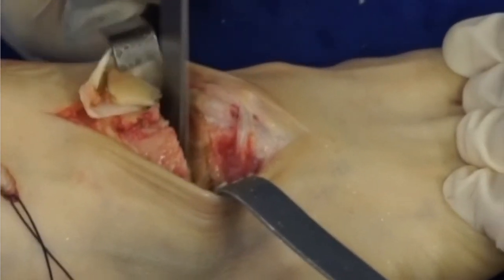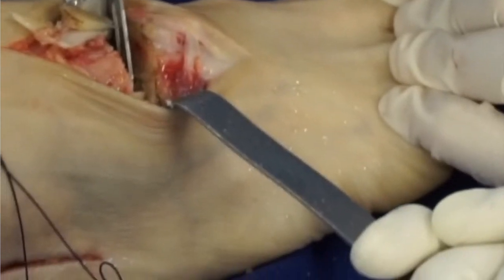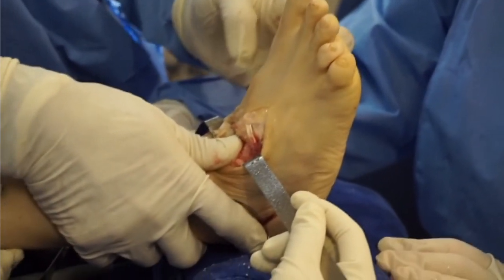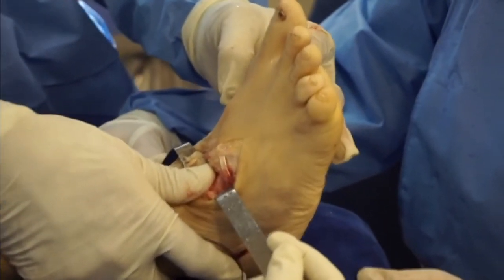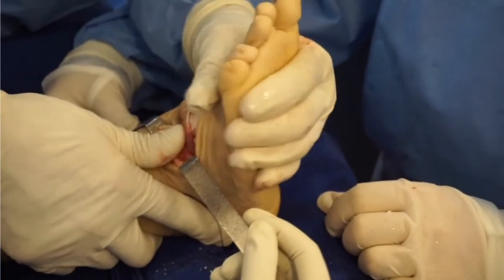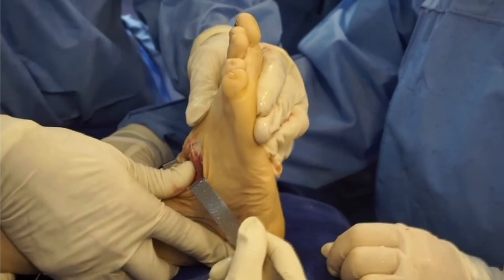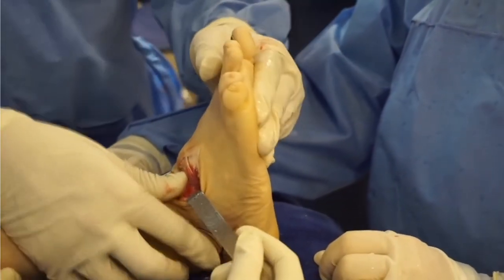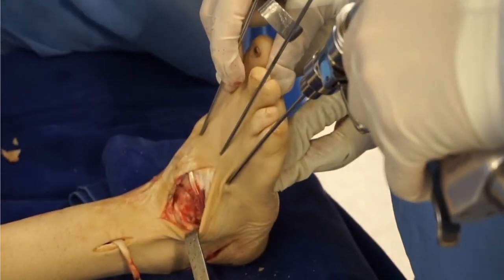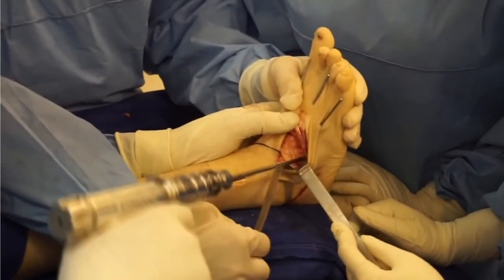The wedge of bone is now easily removed, and once you've got it out, you can actually see the articular surface there quite nicely. Once you've got the foot loosened up, now we dorsiflex the foot, and you can see wonderful correction of that cavus deformity. There's a step-off at your osteotomy-arthrodesis site — rotate the foot, which then lifts up the cuboid and prevents overload laterally. We're going to fix it with three Steinmann pins; I use three-millimeter pins, and three of them is quite sufficient to immobilize that osteotomy. I prefer these pins over the use of screws or a plate.